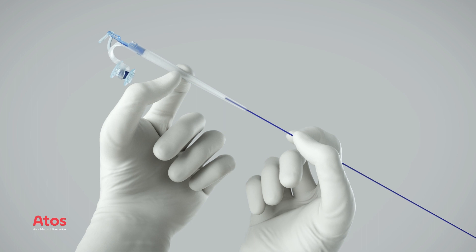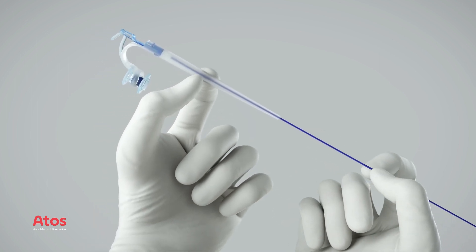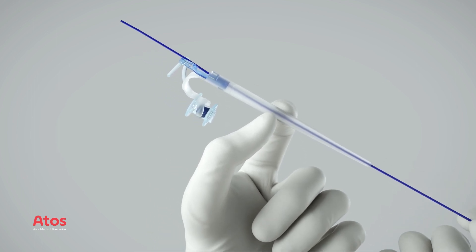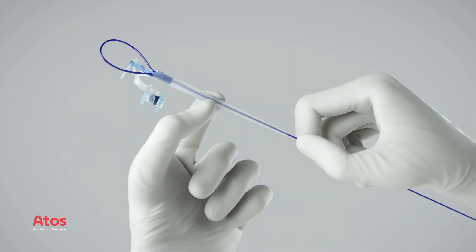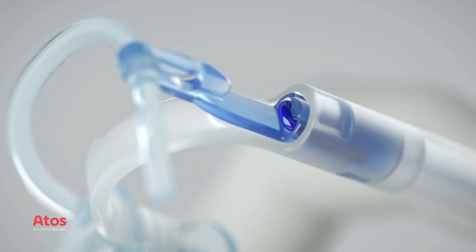Insert the guide wire into the puncture dilator and push the guide wire until it extends approximately 10 centimeters through the dilator exit hole. Grab the tip of the guide wire and insert it in the hole next to the exit hole. Tighten the guide wire and verify that it is secured to the puncture dilator.